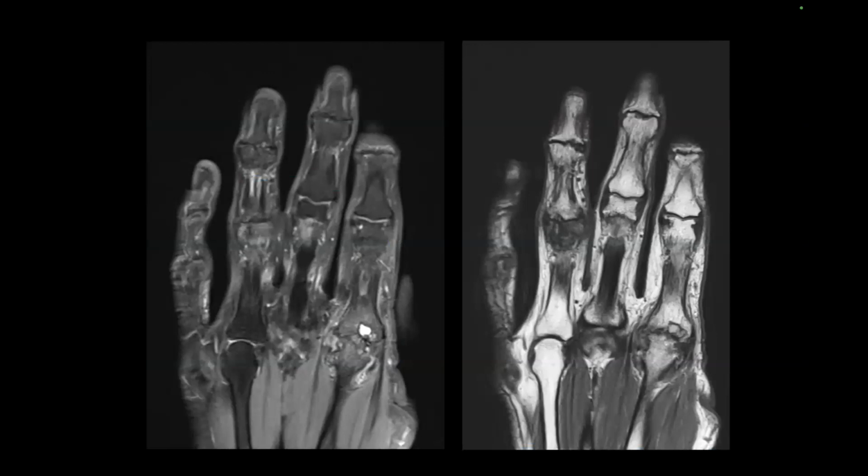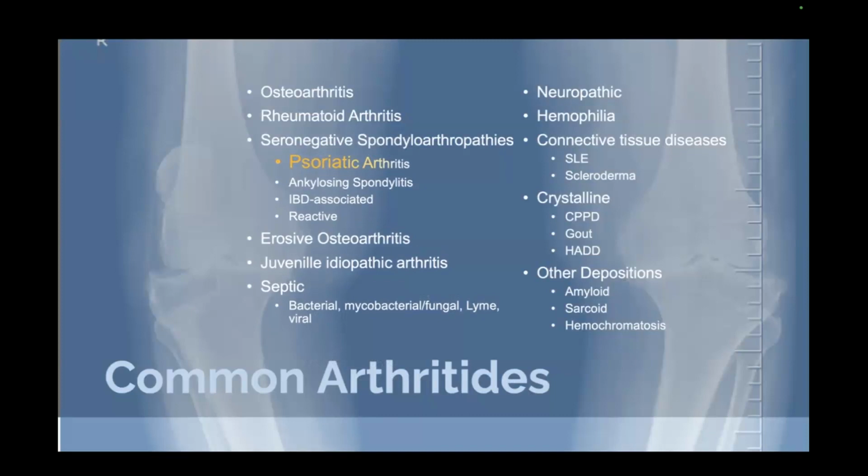Now, this is an MRI on a patient who has active erosive osteoarthrosis. It's predominantly involving the DIP joint, but in this case, it's also affecting the index finger MCP joint. There's bone marrow edema with a synovitis and a small effusion, which is the actively inflamed joint, but the DIP joints that I've shown in these pictures are less inflamed. It would suggest more of an erosive OA rather than a rheumatoid arthropathy.